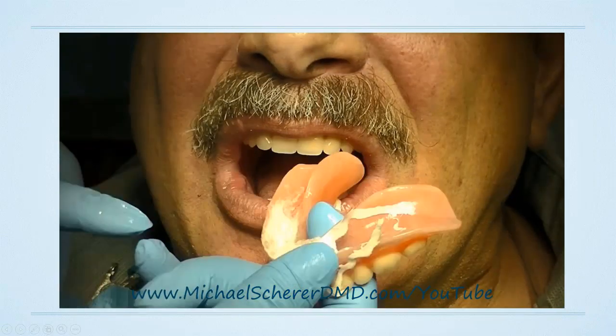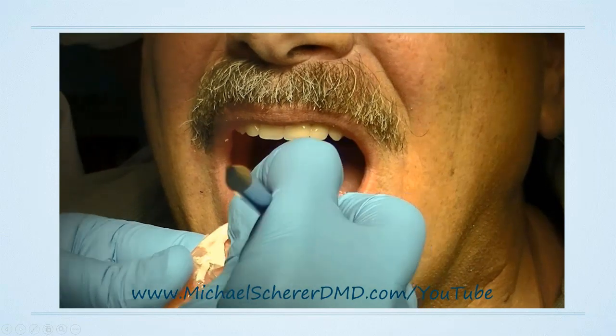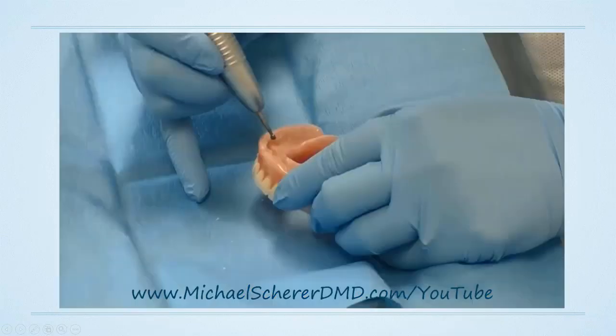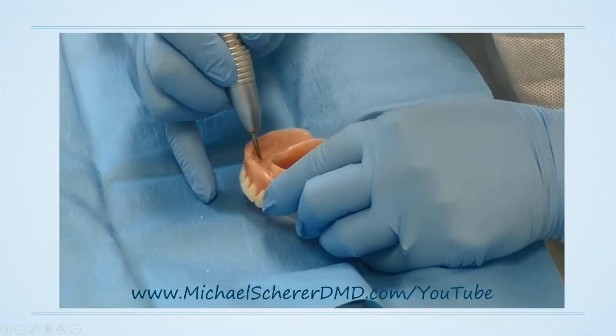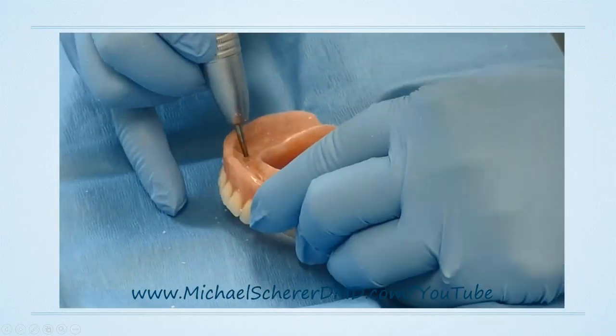This is just showing you a white PVS called Fit Checker. This material will go inside of the denture and show any areas of contact of the denture to the metal itself of the housing. I take a red pencil and mark that little area of show-through. And then I'm going to size my recess appropriately using a series of burrs.